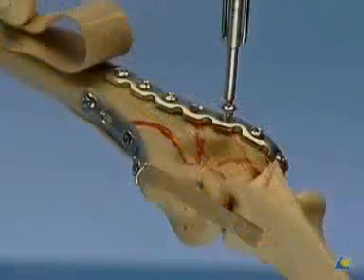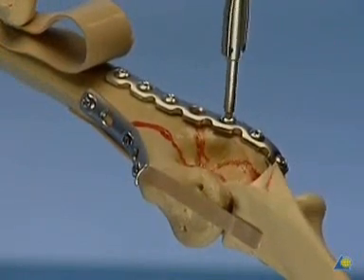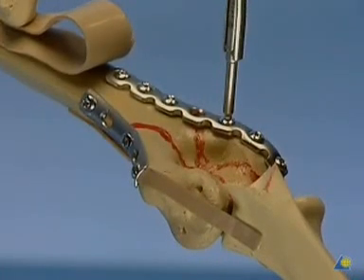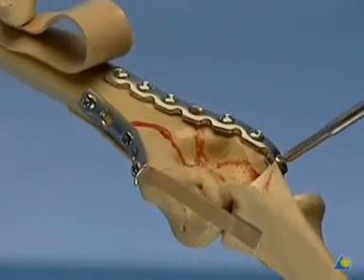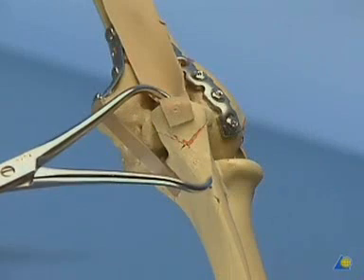Back on the radial side, we complete the fixation by adding a few more cortex screws, their number again depending on how well their purchase is in the bone. At this point, an intraoperative X-ray is advisable to make sure there are no surprises. Finally, the olecranon is reduced and held in place by a pointed reduction clamp.